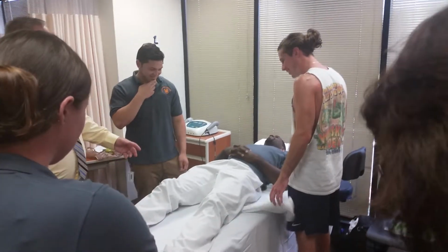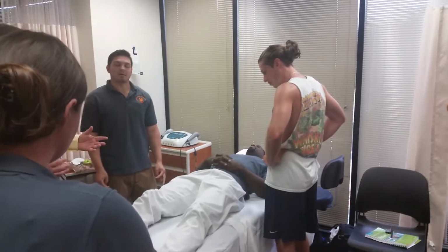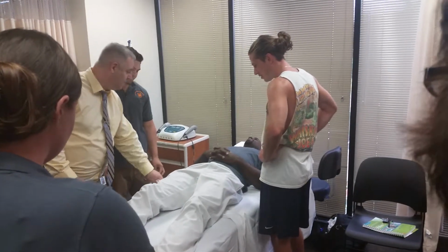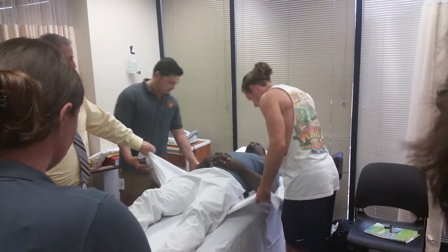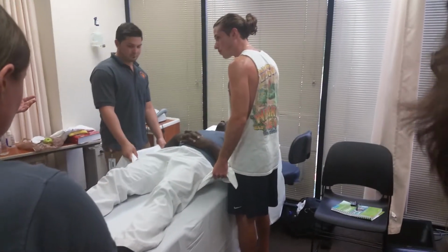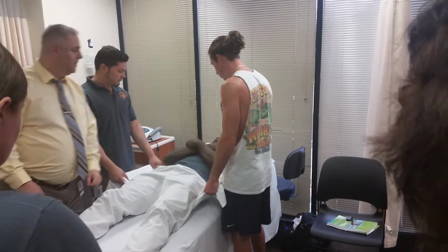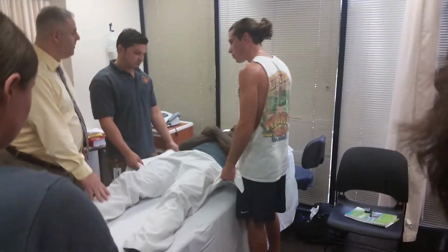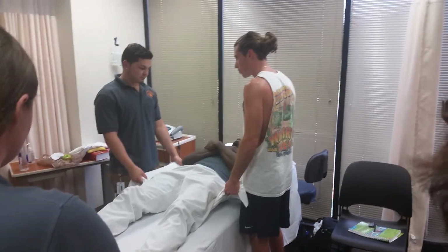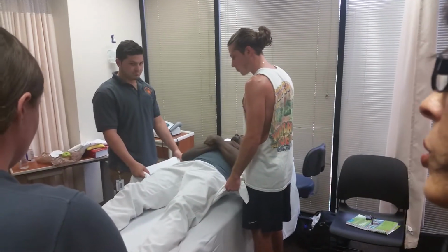All right, so if he lifts more, he's going to hurt himself. So you guys have to try and do it at the same amount. Get ready. What you're going to do is lift his entire body weight up, and you tell your patient to cross their arms and relax. So you're not going to help them at all. How's the table position look for them? Does it look too high or too low?